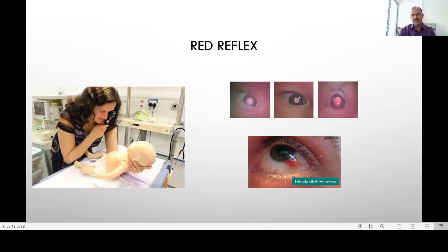This is a normal red reflex. You may have a paler red reflex or a very bright red reflex depending on skin complexion. Fairer skin races have a very bright red reflex, and darker skin ones will have a pale fundus.